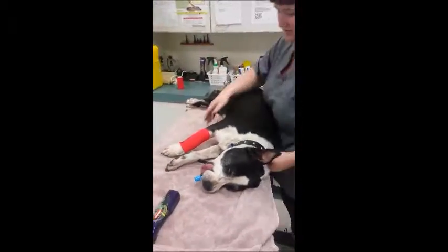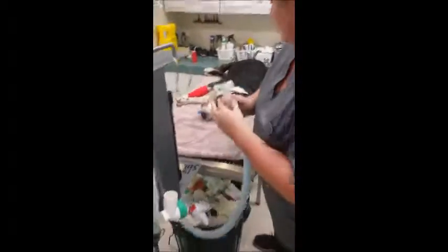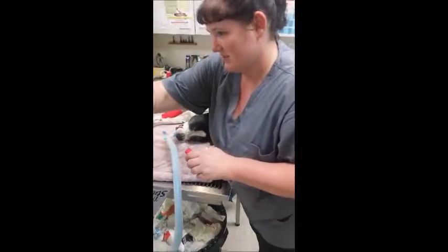I now connect the endotracheal tube to the anaesthetic breathing system. I inflate the cuff using the cuff syringe. Once the cuff is inflated, I turn the vaporizer on to 2% and check the patient's anaesthetic depth and adjust accordingly.